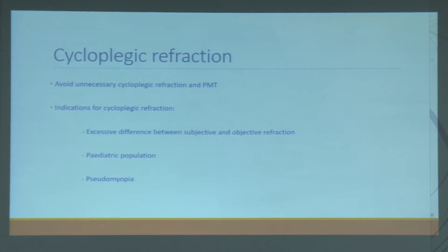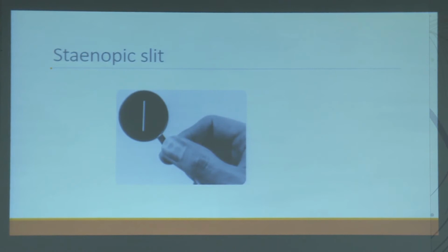So I started off showing a pinhole, multiple pinhole to help you in refraction. This is another thing which is seen in your trial set, but we seldom use. This is called a stenopic slit, which has got therapeutic as well as diagnostic uses. Therapeutic, maybe you can use it in low vision, as a low vision aid in patients with low vision.